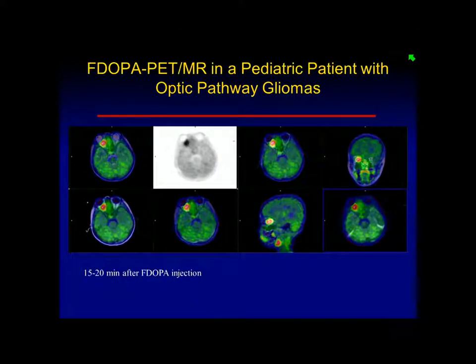And this again is the pediatric case I was talking about with the optic pathways glioma. And again, you can see the uptake in the optic area.